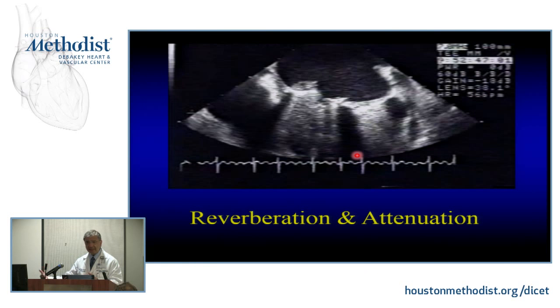So that's the same thing for Doppler in a mechanical prosthesis. Let's say in the mitral position, I can't see anything behind it, and therefore I can't interrogate with Doppler, and therefore I can't understand whether there is regurgitation, yes or no, okay? So attenuation is critical, all right? So I'll put it in the clinics.